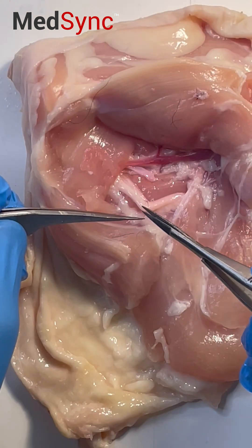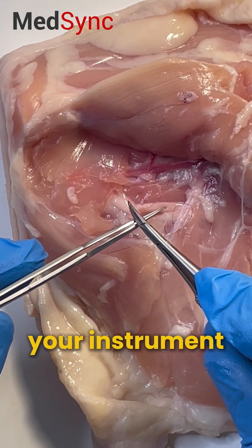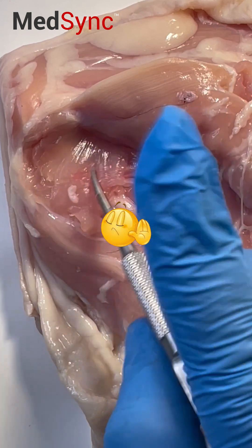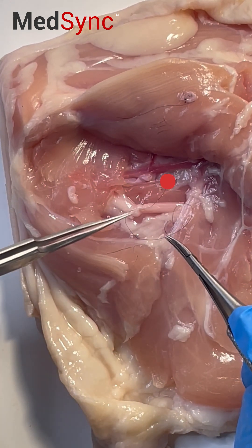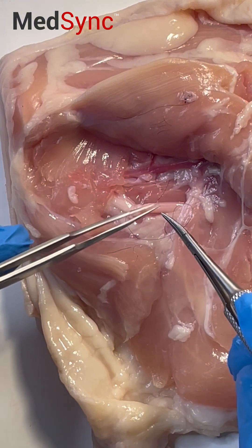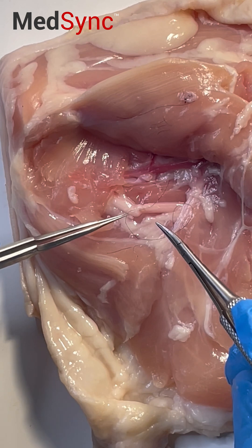This bit is crucial. You never want your hands to cross, you never want your instruments to cross. What you want is to take the short suture with the instrument that's going to pull it towards the direction it's meant to go, to lay a square knot.